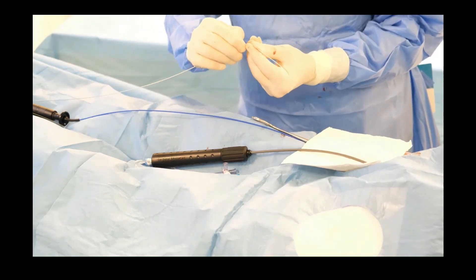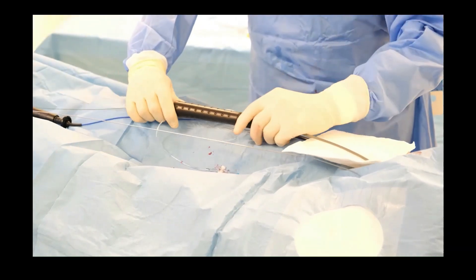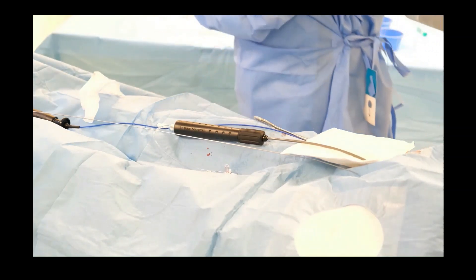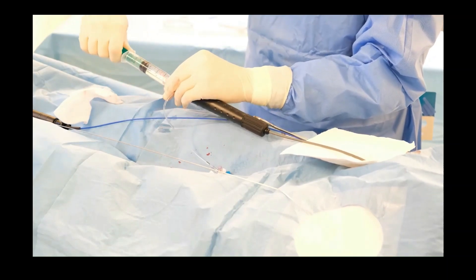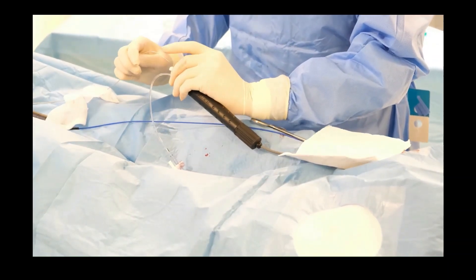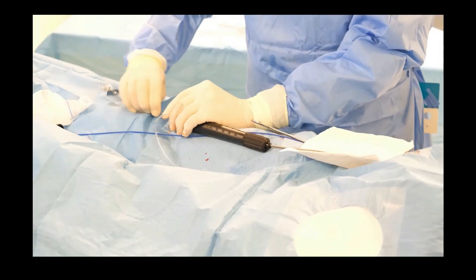Prepare the needle — I used to bend it a little bit, 10-12 cm from the tip. Remove the wire and flush the dilator. Now introduce the needle and let it rotate freely.